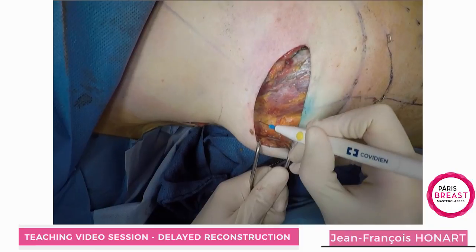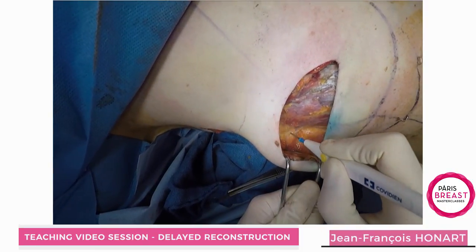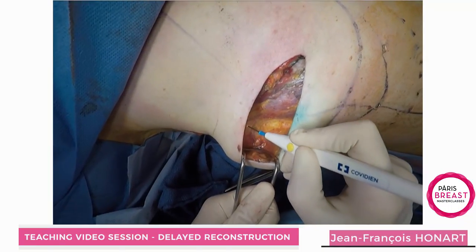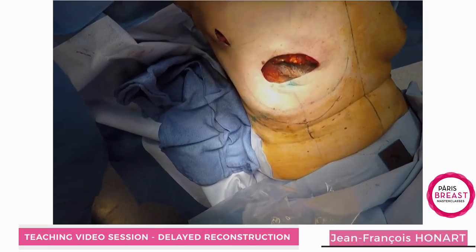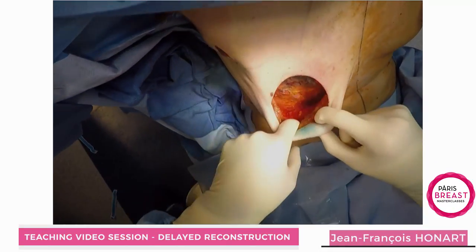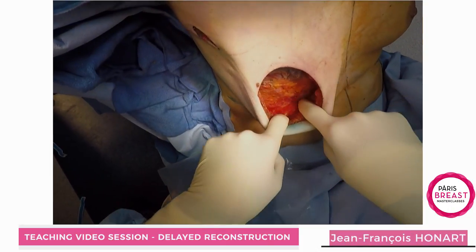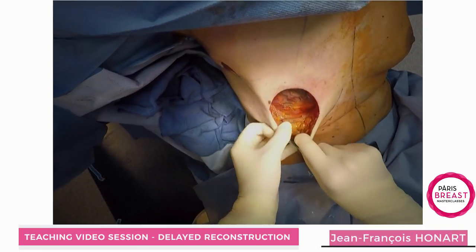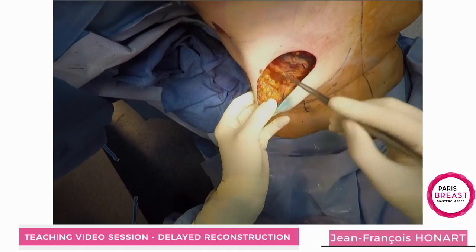We were lucky for this patient — she has quite good quality fascia, but sometimes the fascia is very thin and you can draw holes into it, so the coverage of the expander is not good. We have already done the abdominal advancement flap, and we will now recreate the inframammary fold.